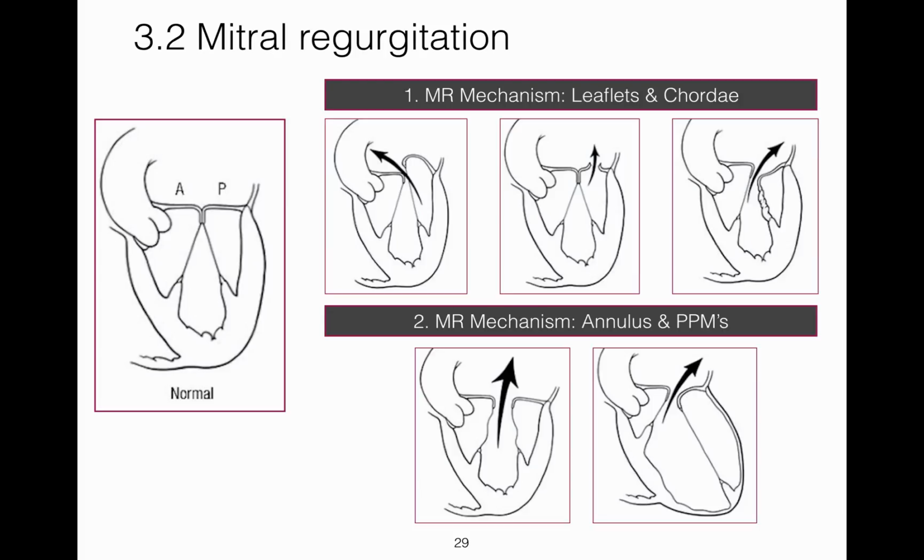Mitral regurgitation is due to a defect that prevents the mitral leaflets from closing fully. There are a number of diseases that cause mechanical impairment of one or more of the components of the mitral valve, including diseases that impact the leaflets themselves, that result in annular dilatation, or diseases that impact the subvalvular apparatus. Careful 2D and Doppler assessments can help to identify the underlying cause.